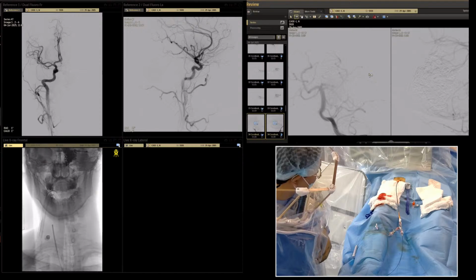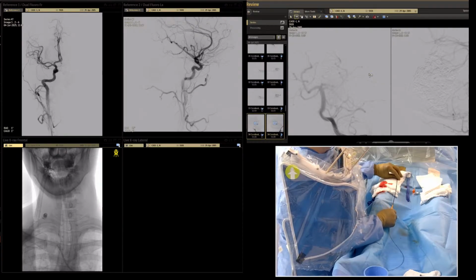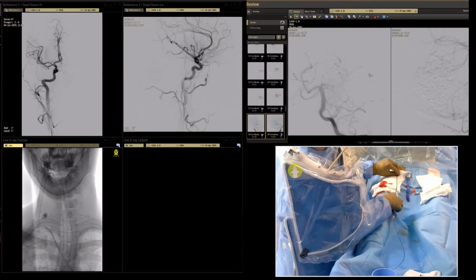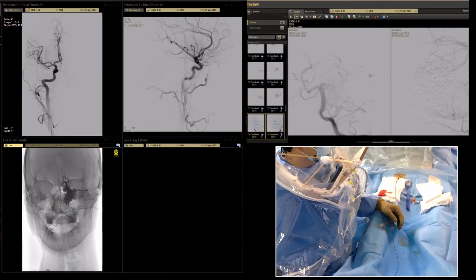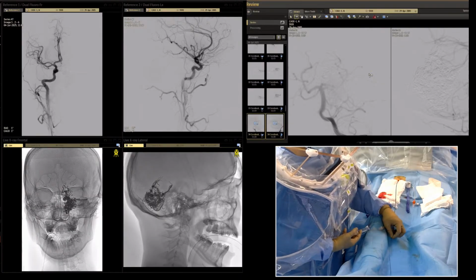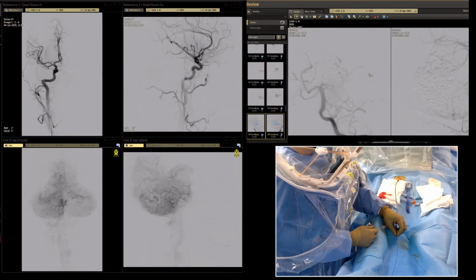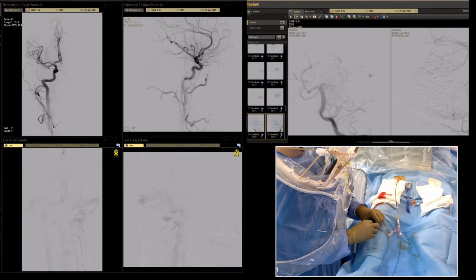It's very important to check the territory. There is a meaning. The dural territory is cleaned, and for the next time we may focus only on the PICA. It will be quite safe, and we did the control with the Headway Duo in the territory, but let's do it with the microcatheter. No venous delay from the microcatheter, but from the guiding the picture is the same.